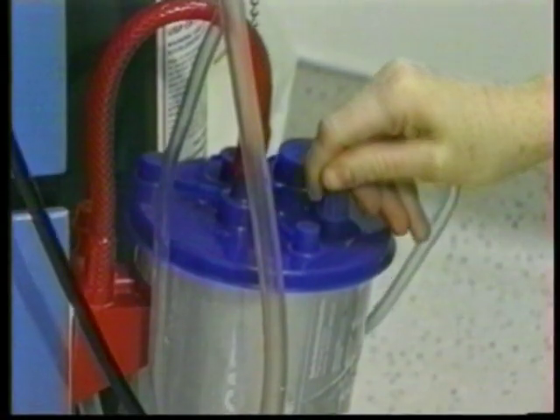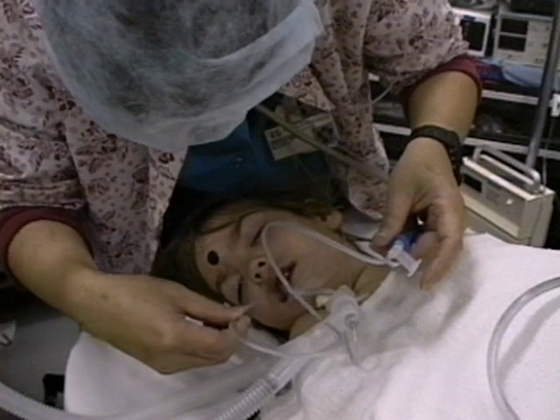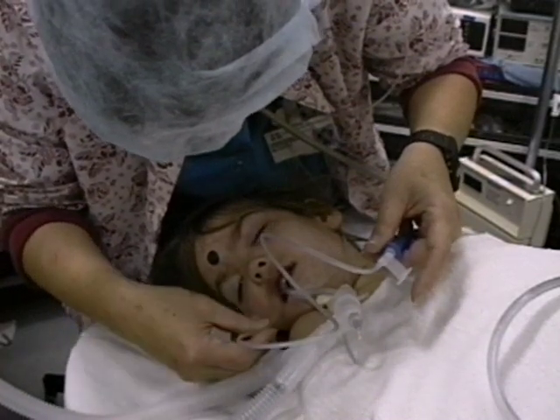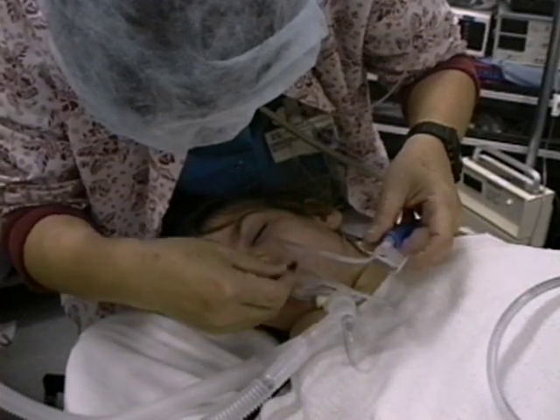Have your suction ready for use. In addition to a usual Yankauer suction tip, have soft suction catheters small enough to suction inside the smallest endotracheal tube you intend to insert.